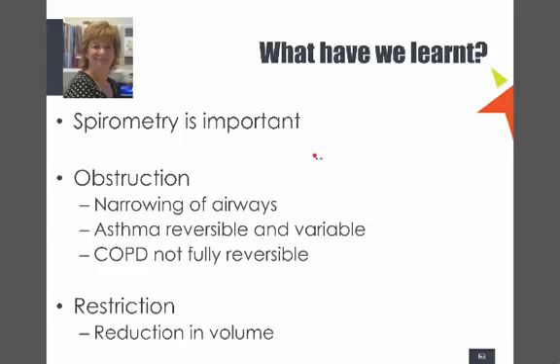Obviously, if someone tells you that they're okay, but you can improve their airways by 12% and 200 mils using Ventolin, their airways aren't optimally open, and that often happens with asthmatics. They accept being a bit unwell, being a bit wheezy, and waking up a bit at night as just part of their asthma. So you can use it for that.